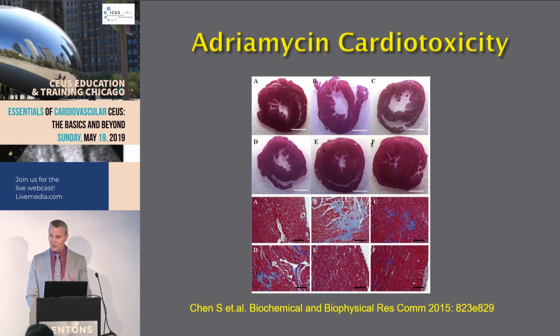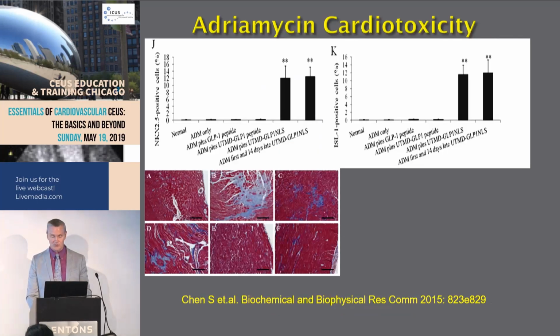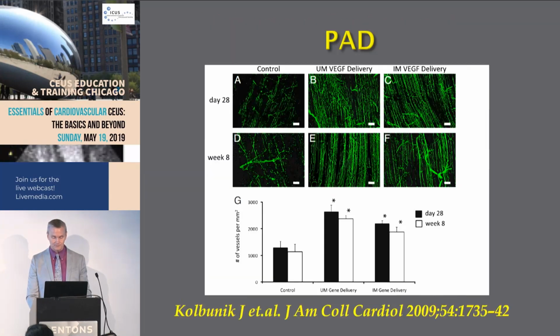They were able, by administering the glucagon-like peptide bound to a plasmid in the presence of the microbubbles, to force that FOXO1 out of the nucleus, and that was the mechanism that seems to be responsible for reversing this cardiomyopathy. So it's amazing work that they're working on now in larger animal models, demonstrating this targeted delivery technique where that high MI impulse is basically used to destroy the bubble at that site to target its delivery of a gene that then could be used potentially for adriamycin cardiotoxicity.